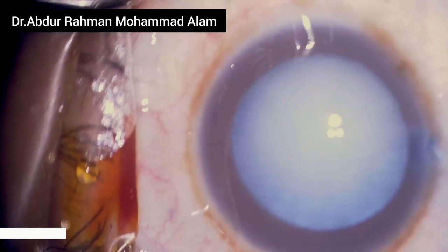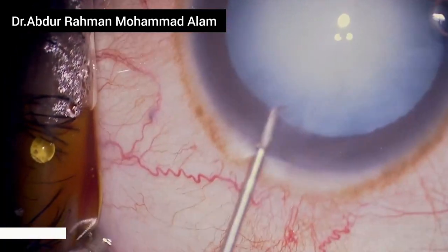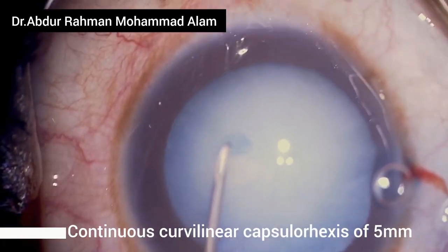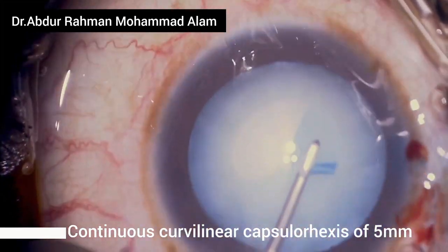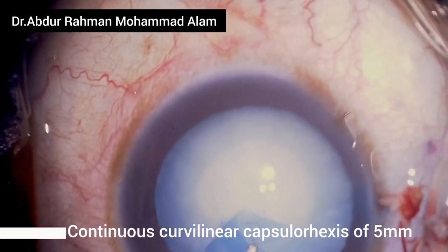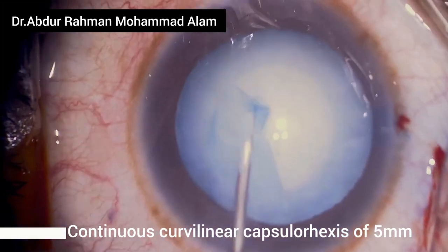I have already stained the anterior capsule with blue dye for enhanced visualization during construction of the capsulorrhexis. I incise the anterior capsule about 2.5 millimeters and raise a flap, then guide the flap in a centripetal manner and tear the capsulorrhexis. Always lay the flap flat on the anterior capsule.